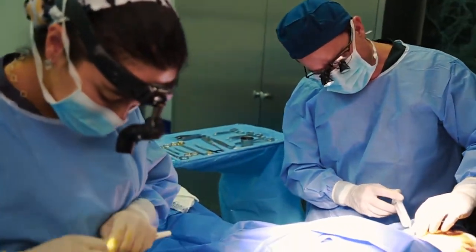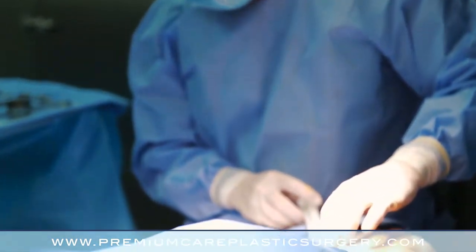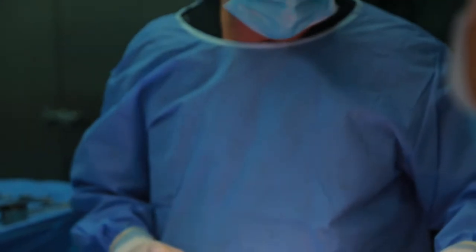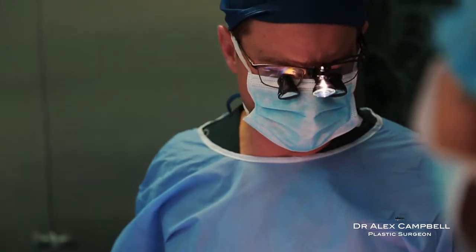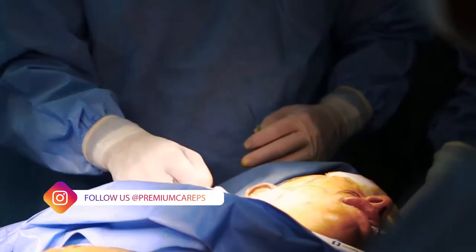So we are just ready to get started here. What I am doing is injecting the facelift. We are going to do a nice full infiltration so that we don't get bleeding. This is a young patient — she is 39, pretty young for a facelift, but she is starting to see the early descent of her mid-face, jowling, and some laxity in the neck. So she wants to be relatively aggressive about keeping her youthful looks and looking tight.